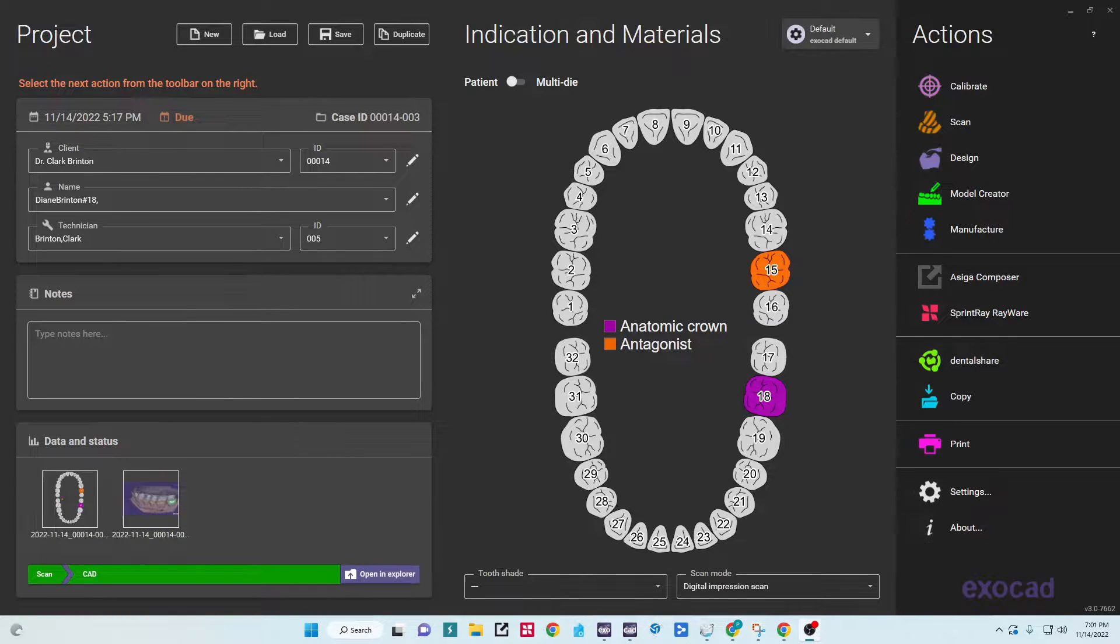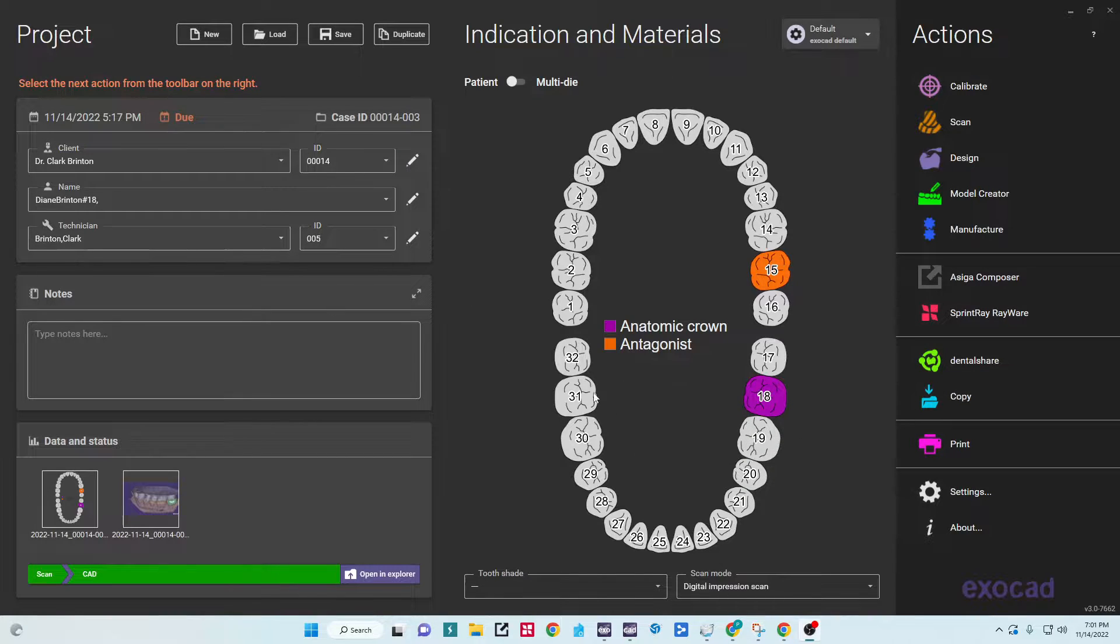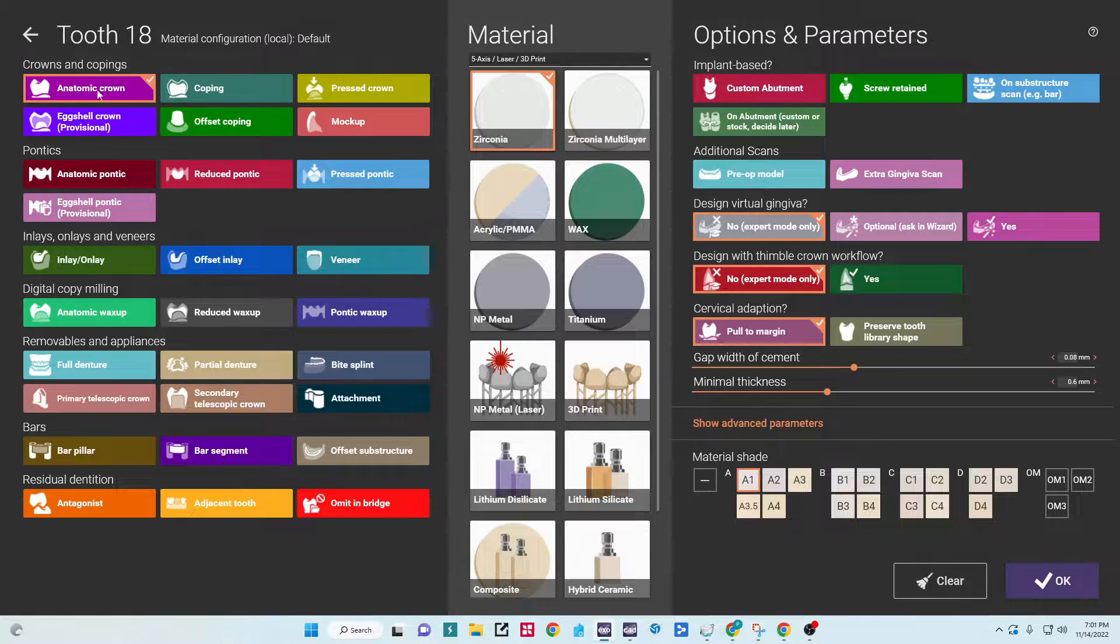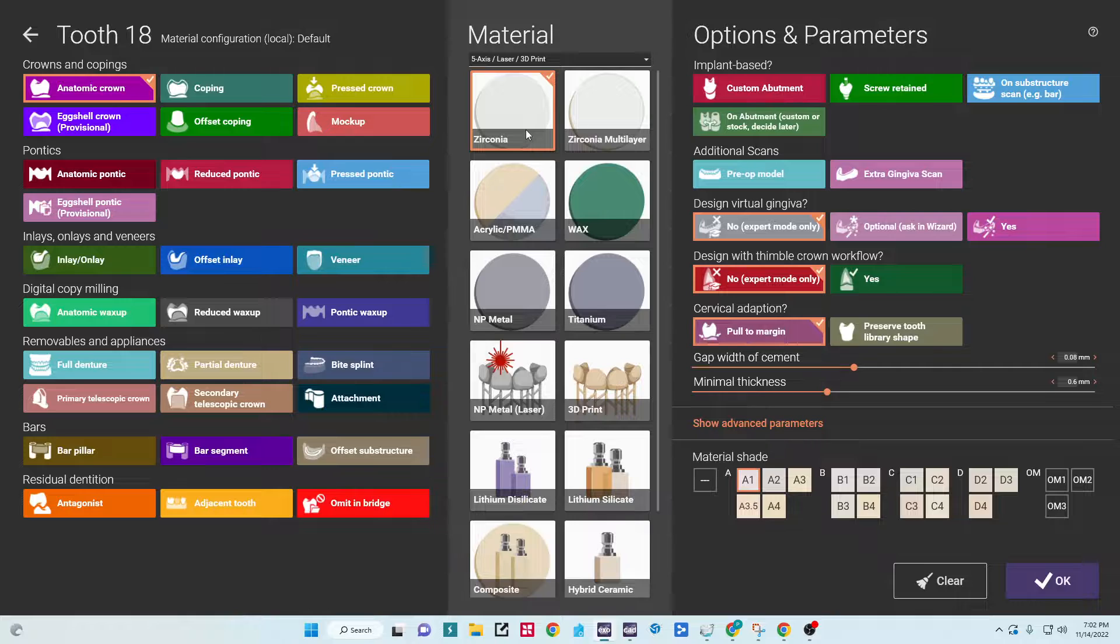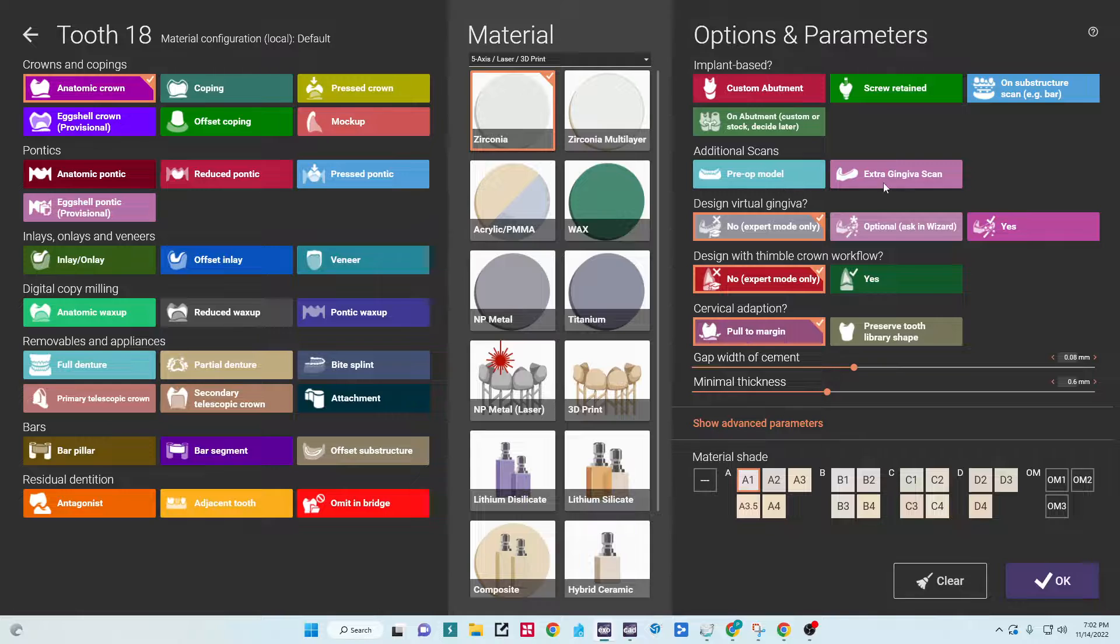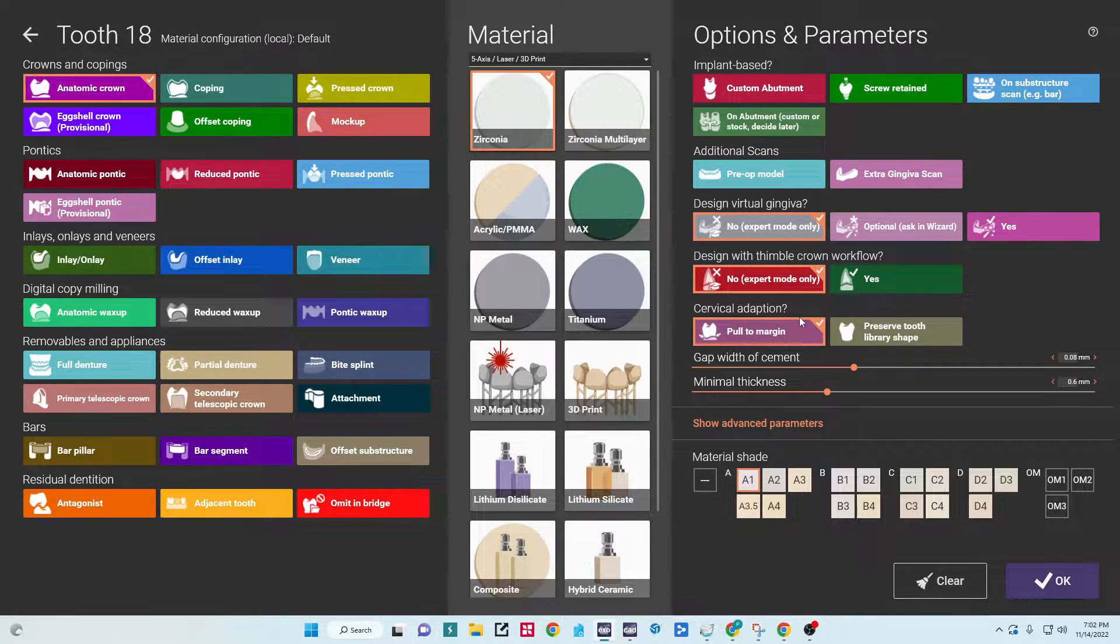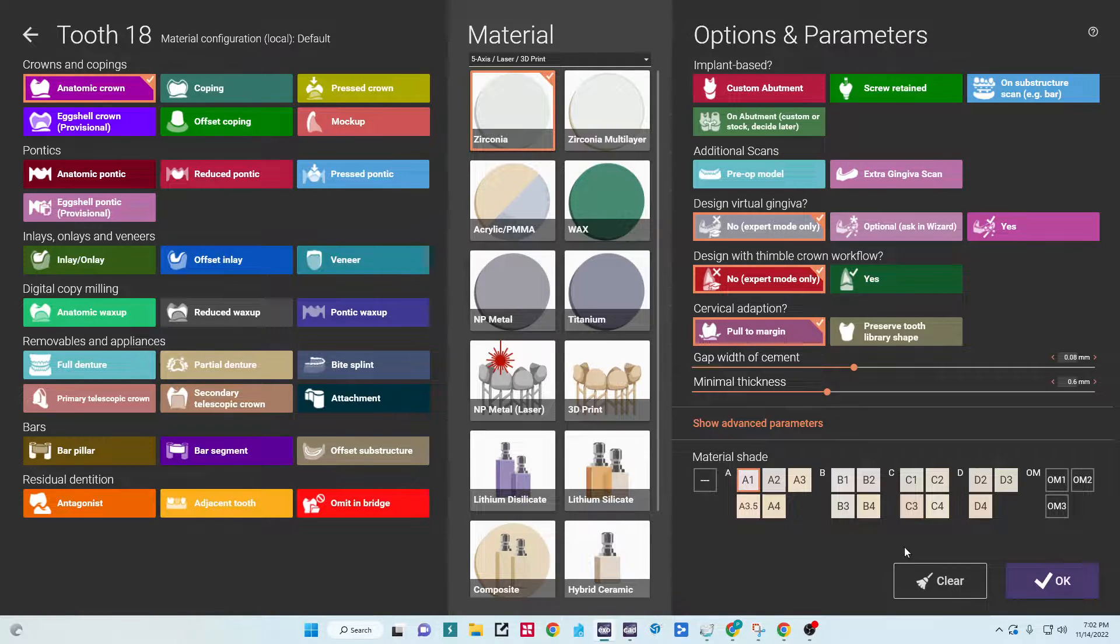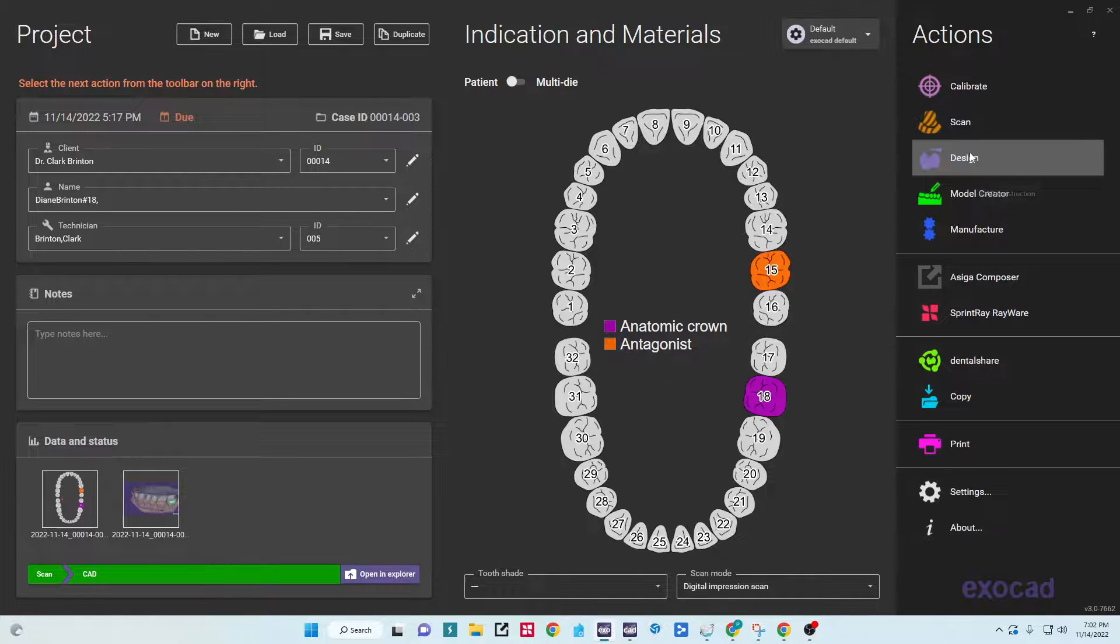I will be designing a single posterior crown number 18 with the client name tech. We're going to select the crown, working on selected anatomic crown material zirconia. This is just a simple crown, we won't select anything here, no virtual gingiva, no thimble. We'll have it pull to margin as the best way for the cervical adaptation, shade A1, click okay, and then we'll go into design.